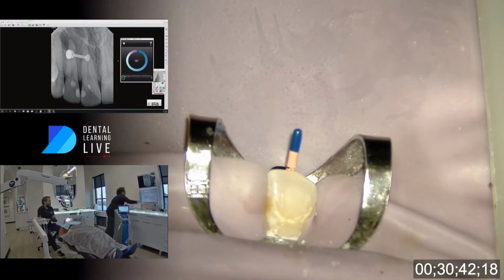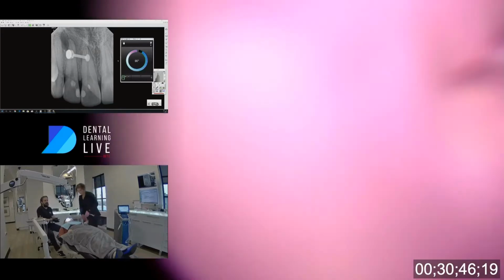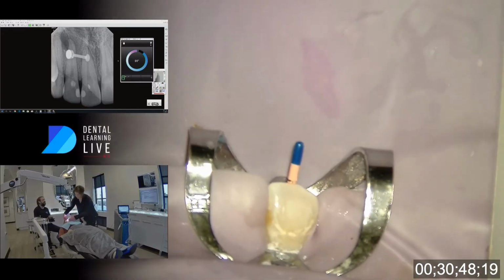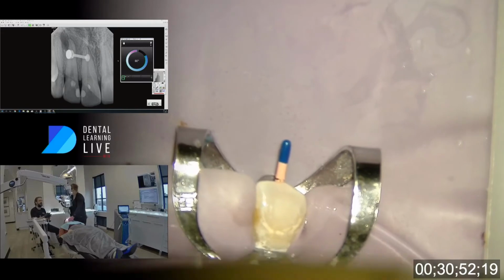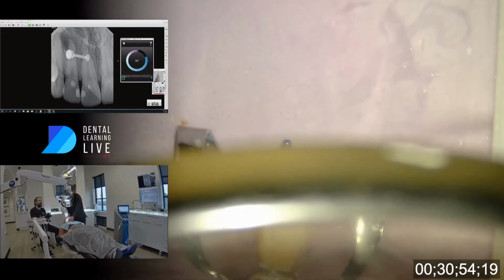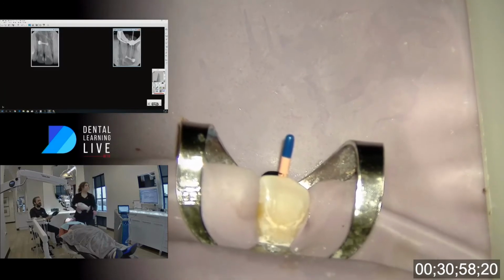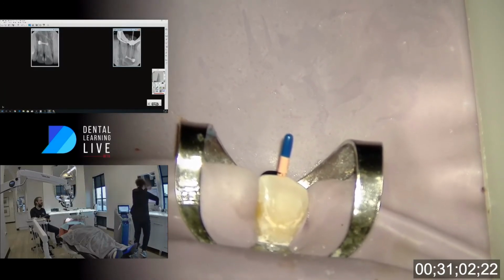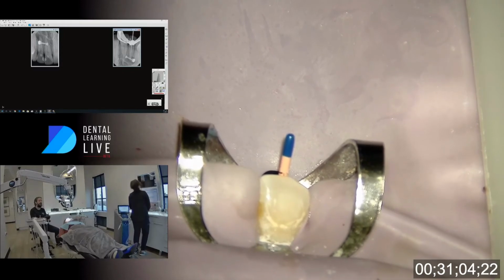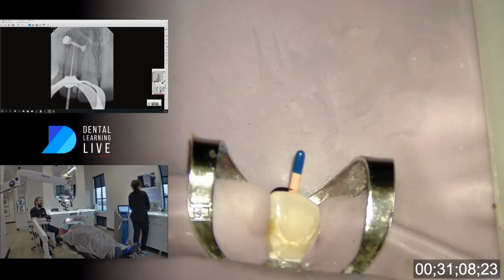You know what? The first thing that's changed is I've gotten smaller. The sizing, I mean, you're limited to what you're given, and that might be in a retreatment what the previous shape was. Or in natural anatomy, I mean, I've done this on as large as like a size, apical gauge size of 120. In some trauma cases, you really see that. So, you know, I try to respect as true to form as possible.